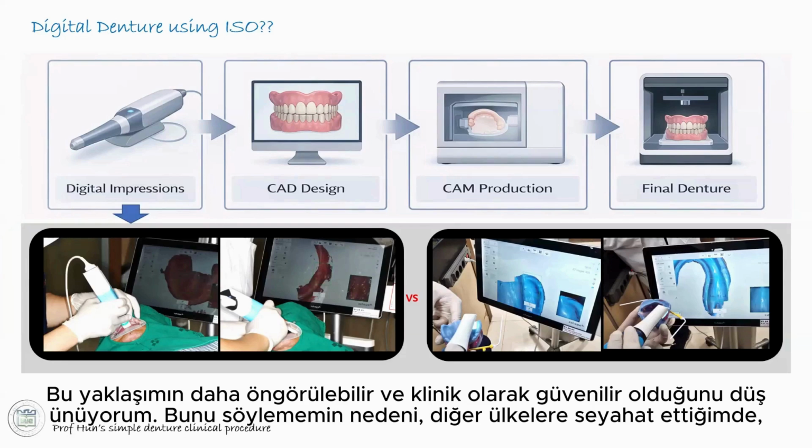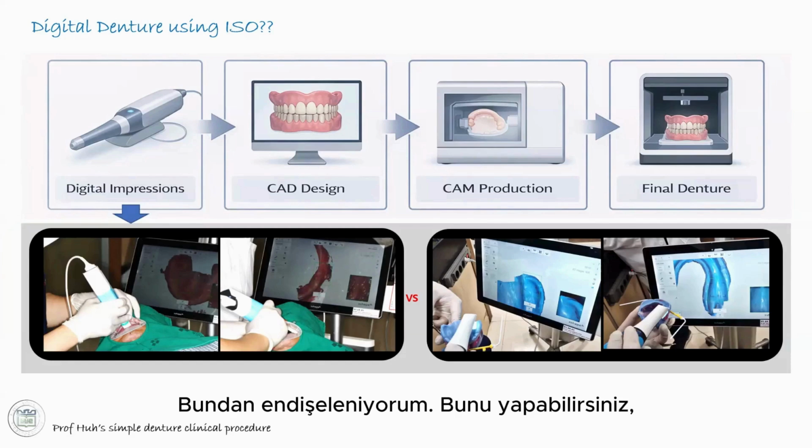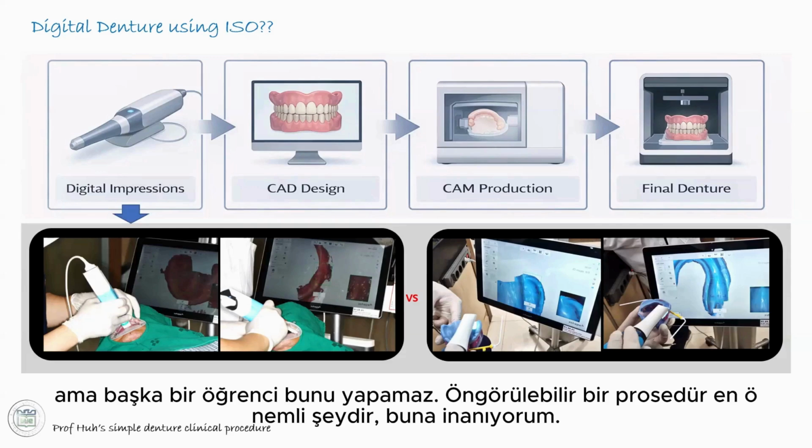The reason why I say this is that when I travel to other countries for my lectures, I meet many dentists who like to scan directly with an intraoral scanner. So I worry about that. You can do it, but other students cannot do it. So anyway, a predictable procedure is most important.